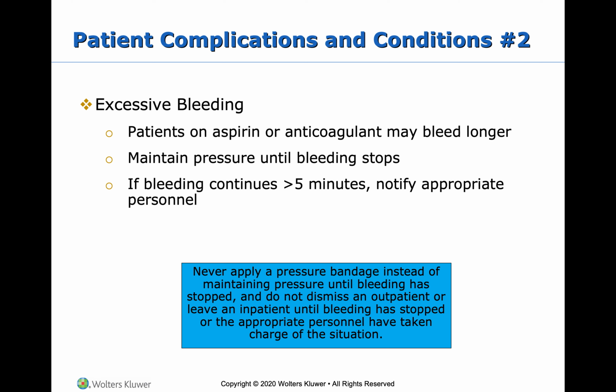Excessive bleeding. You guys remember me telling you the story about the patient that was on blood thinners who left and came back 2 minutes later with blood dripping down his arm and his sleeve saturated with blood. So definitely make sure that you are holding pressure on the site until the bleeding stops before you wrap it.